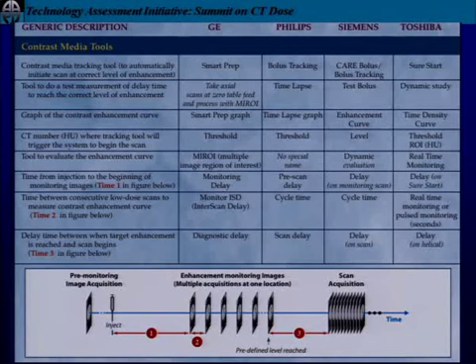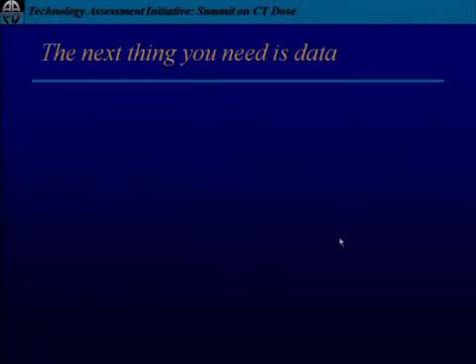Some of the names can be so close that we found them pretty difficult to keep straight. This is the bolus tracking, where you inject, you wait some amount of time and take these spot checks, if you will, to see where the dye is, and then from there start to scan. There's a couple different delays: to the first one, between images, and to the scan pack, and they all had names that were so similar we, again, resorted to a dictionary.